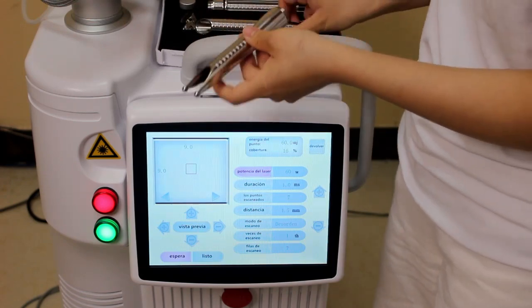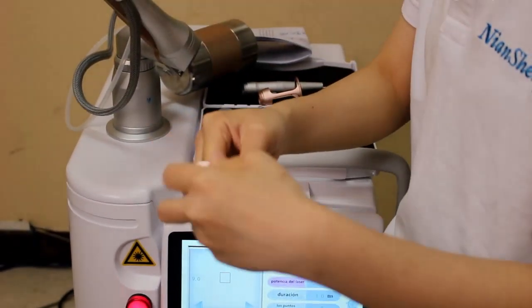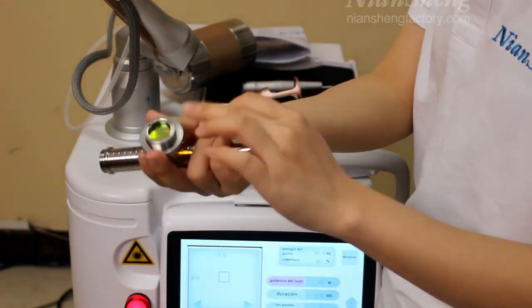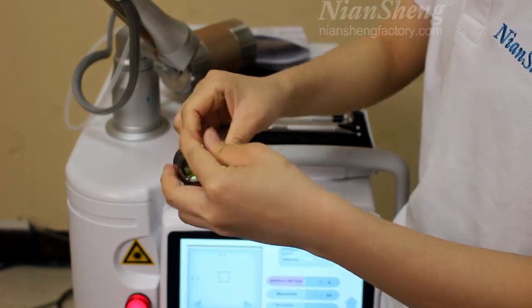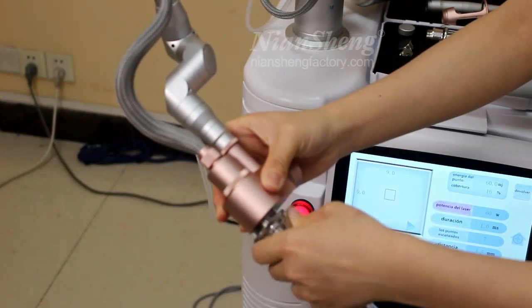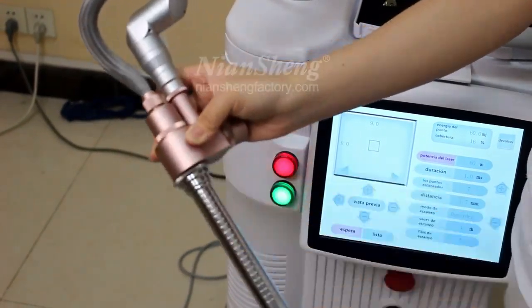Now I will show you how to install this handle. First, we need to connect this mask — very easy. That's okay.